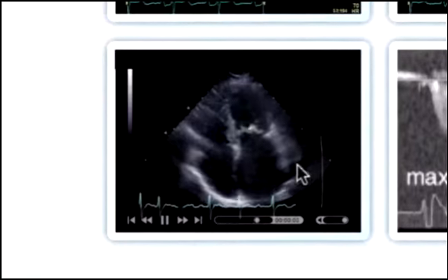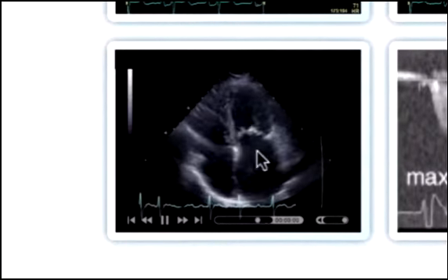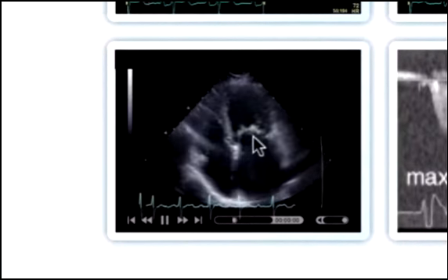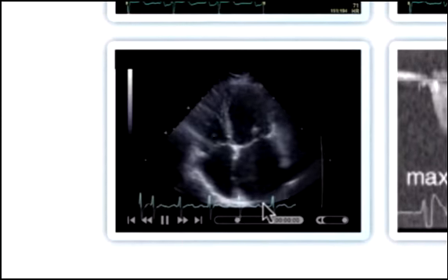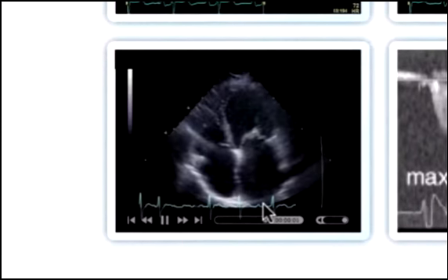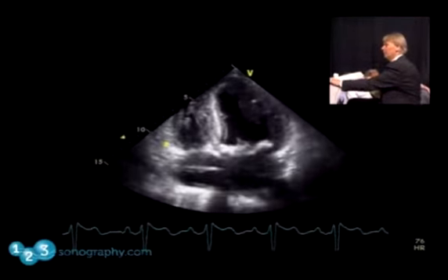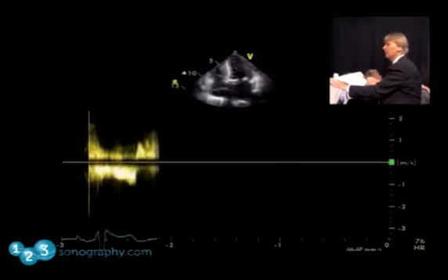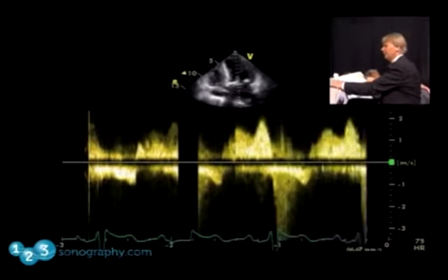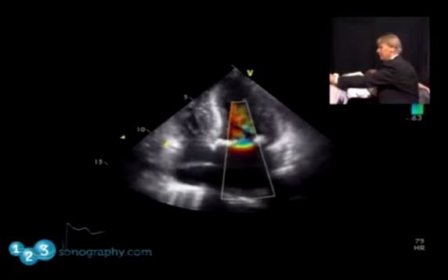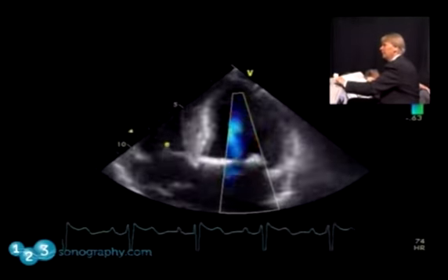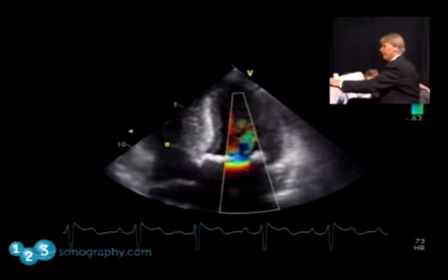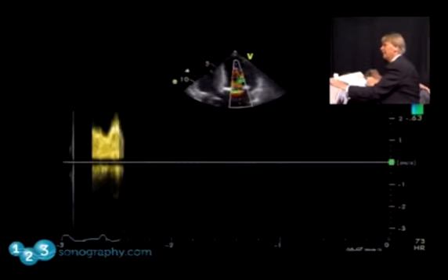Here's a patient with a very large atrium — again mitral stenosis — and also an enlarged right atrium. Take a look at the shape of the atrium; it's more round. We'll put the continuous wave Doppler spectrum across the valve. We could probably get a better signal if we really use the 2D color to guide us.